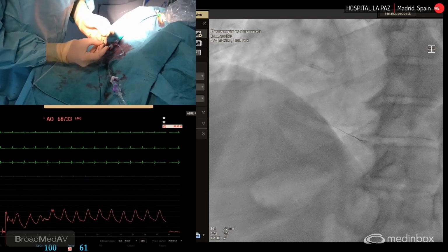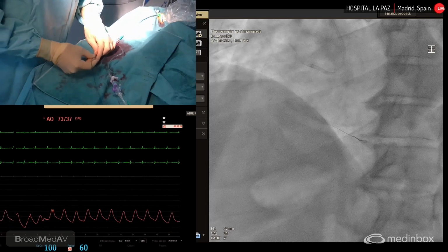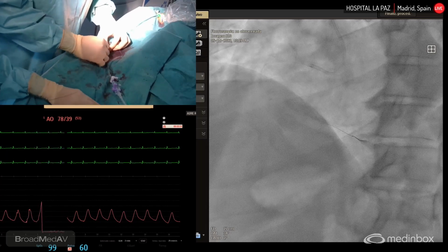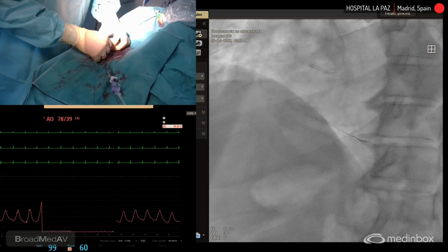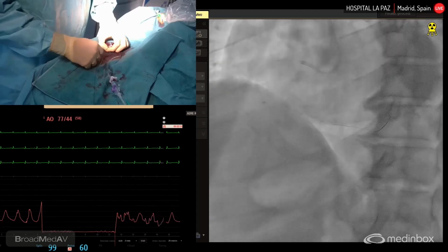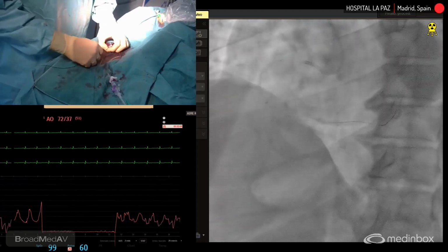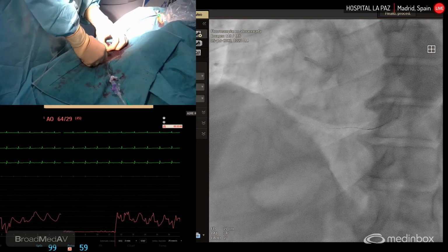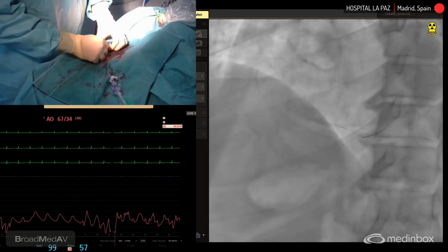This is the laser catheter. It's a monorail catheter, 0.9, and it's the catheter that allows to apply the maximum energy and the maximum pulse repetition. So deploy the maximum energy. Sorry, can you quítame las gafas, por favor? Gracias.